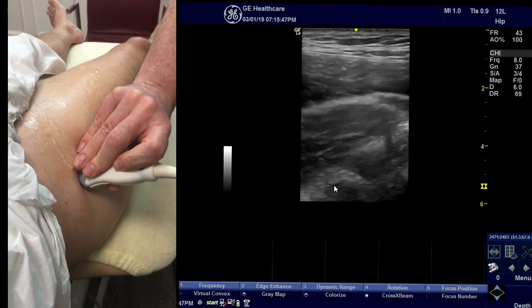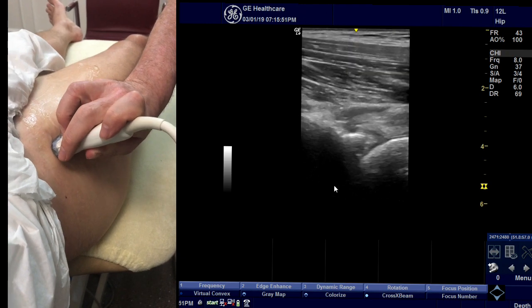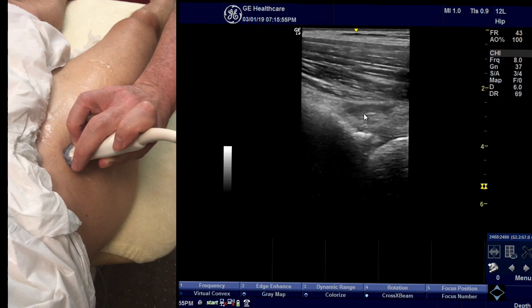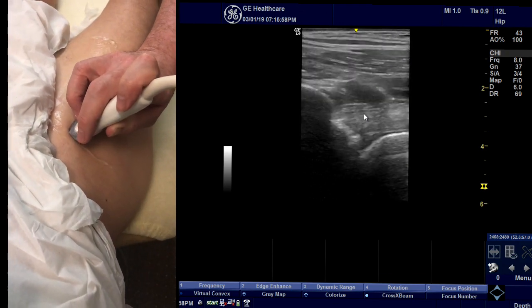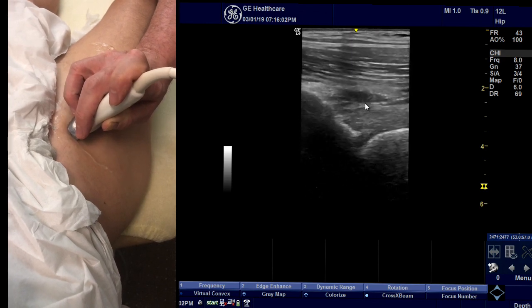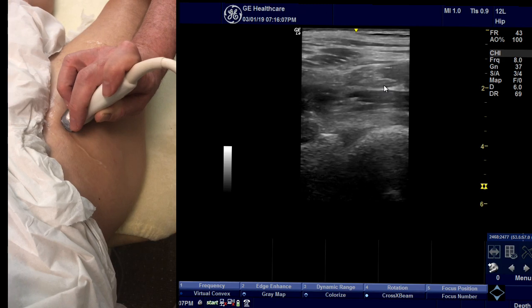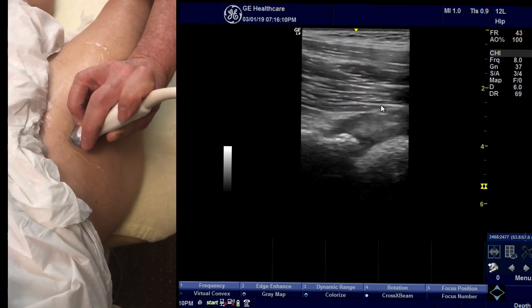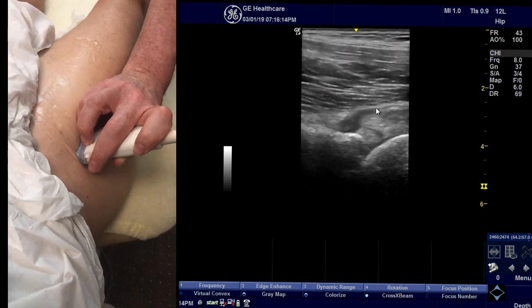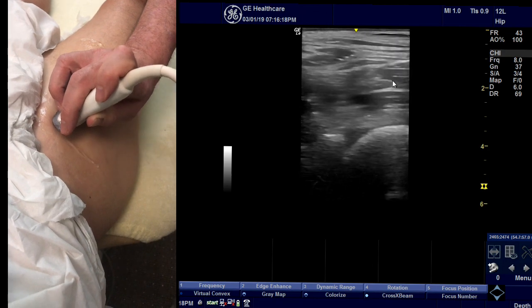You can also turn into short axis and follow the fibres up. This is it here with a little bit of anisotropy to make it slightly easier to follow. You come up and then see those fibres reaching the muscle belly and blending in. Then back down onto the acetabulum in short axis and back up, blending with the muscle.